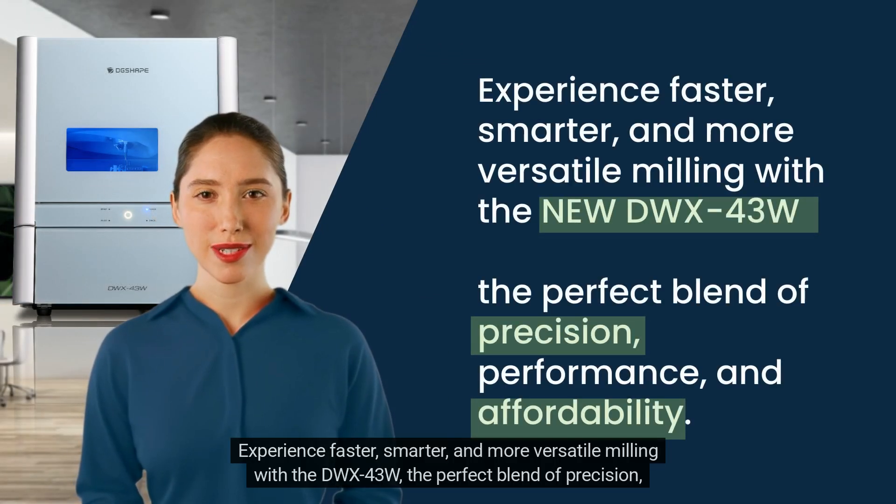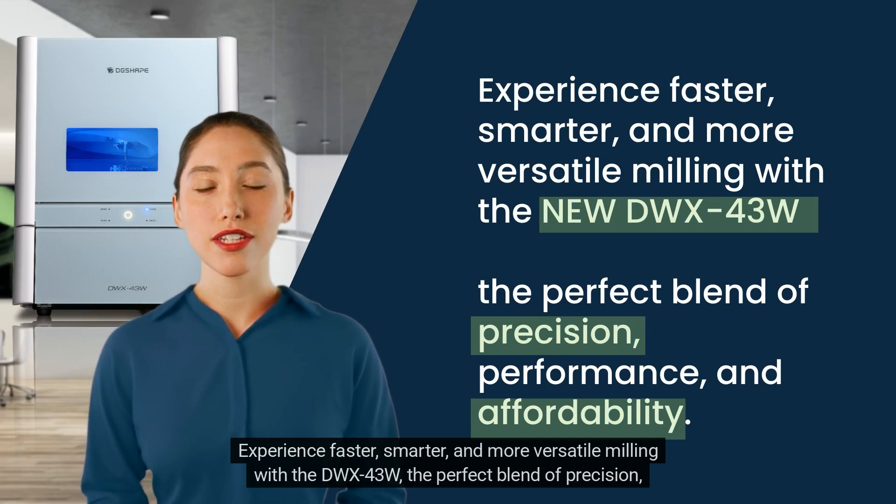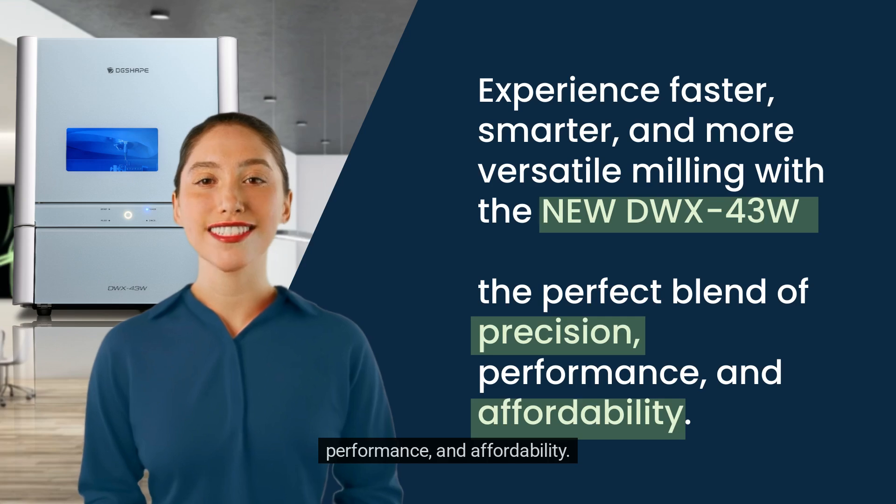DWX43W users can also access performance visualization software through DGShape Cloud. Experience faster, smarter, and more versatile milling with the DWX43W — the perfect blend of precision, performance, and affordability.